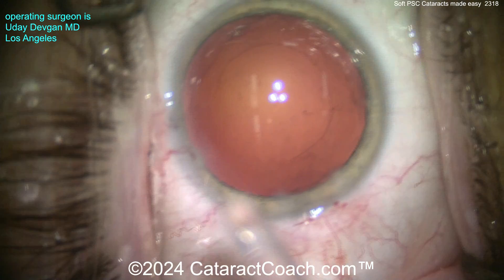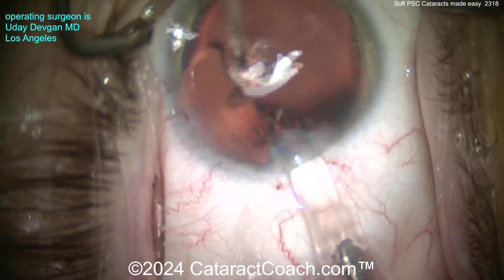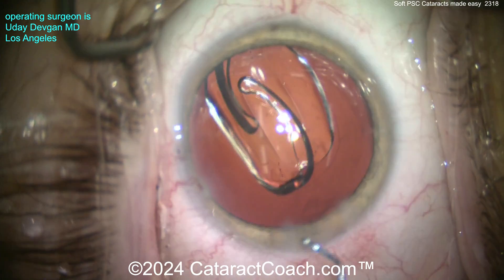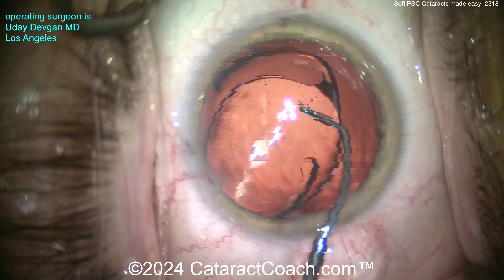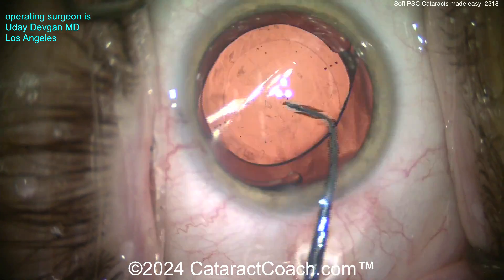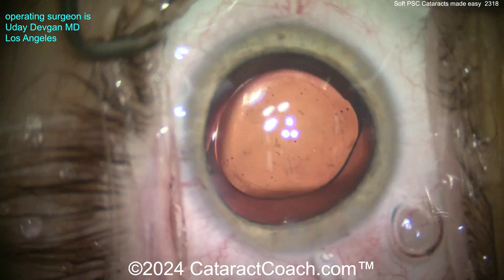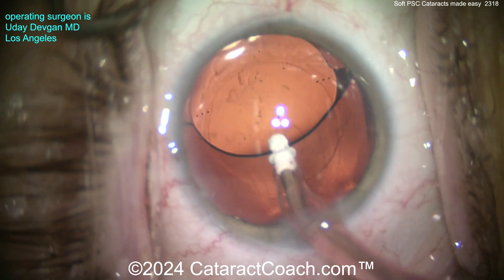Here comes the lens — getting the IOL into the capsular bag, nice and easy, slow delivery. It looks like a monofocal lens, also appears to be a toric lens, so we get that lined up at the appropriate axis. And look at that rhexis — I took my time because I wanted a really beautiful rhexis, and I think we really achieved it. That's a beautiful looking rhexis with 360-degree overlap.